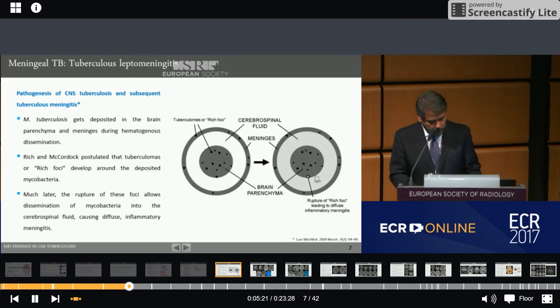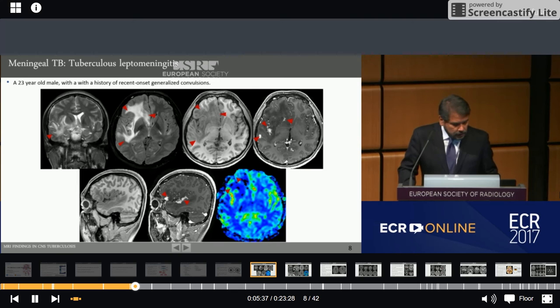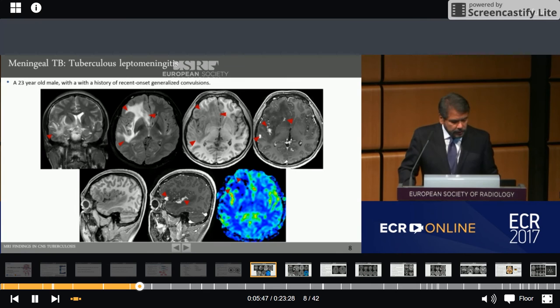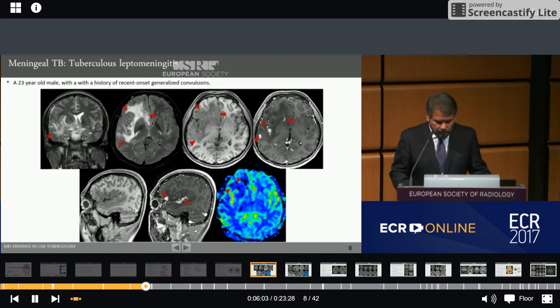Regarding tuberculous leptomeningitis: this is a 23-year-old male patient with a history of recent onset generalized convulsion. T2 and FLAIR images show an area of vasogenic edema in the left superior temporal gyrus and the left frontal lobe. Post-contrast T1 images show patchy gyral enhancement associated with meningeal enhancement. RCBV color map shows marked hypoperfusion with no evidence of high perfusion areas in the peripheral enhancing portions.